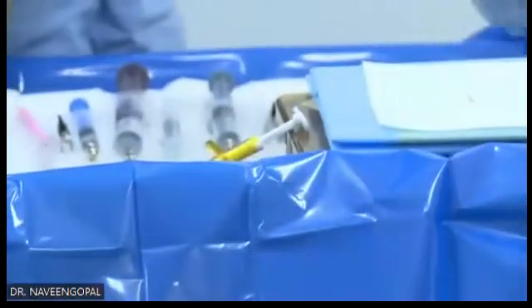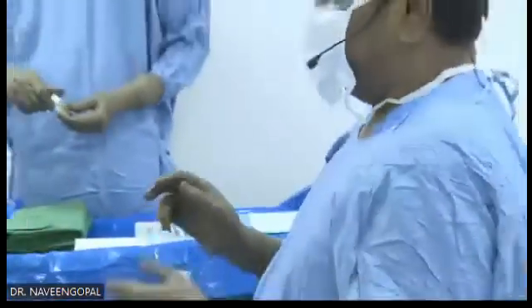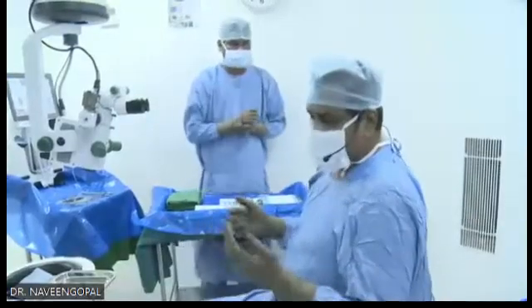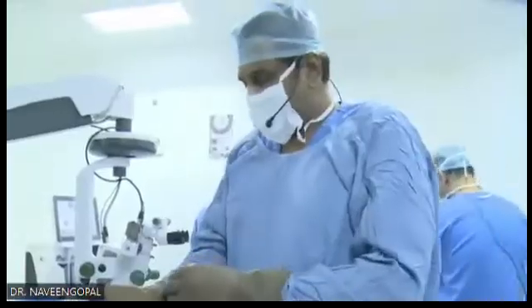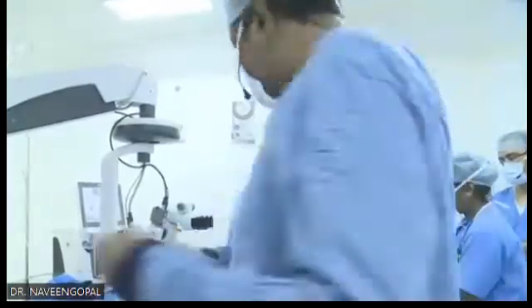Now I keep it in the saline like this. Since it is a hydrophilic material, you cannot let it dry. If you let it dry, it will become brittle and it will cut. So that is one more thing. Usually I change the gloves since my gloves are smeared with this Visco. I usually change my gloves now because they have become slippery.